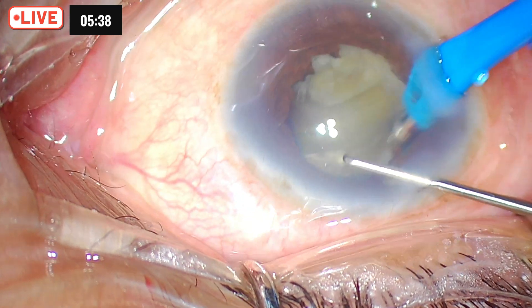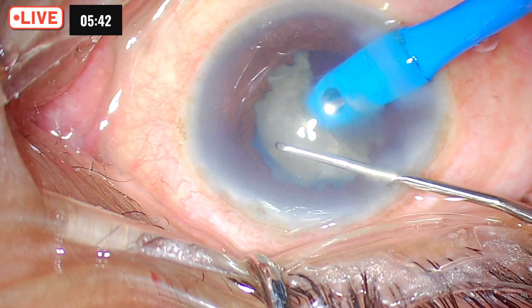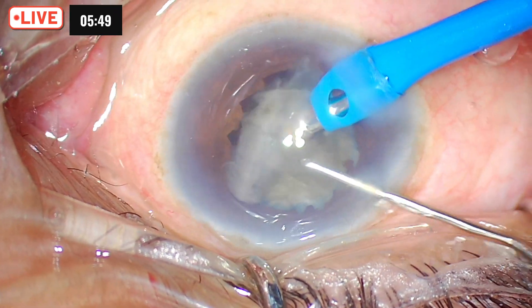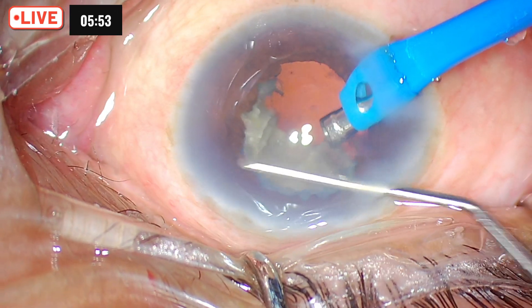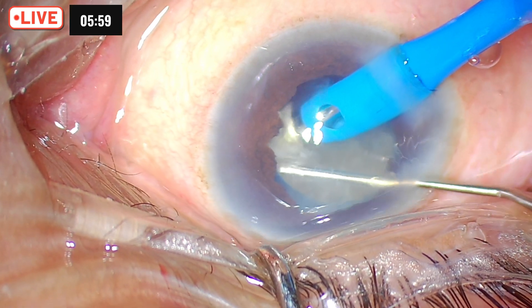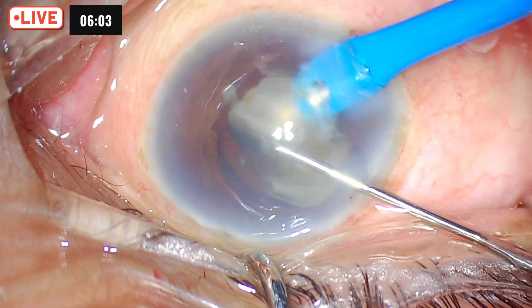We could avoid using a B-hex pupil expander in this particular case. The direction of the chopper always has to be vertically downward — that is when you get the maximum and effective depth of the chopper. If you go in a slanting manner, you will never get the complete depth. Go vertically downwards into the depth of the cataract and it creates a beautiful split of the cortical fibers.